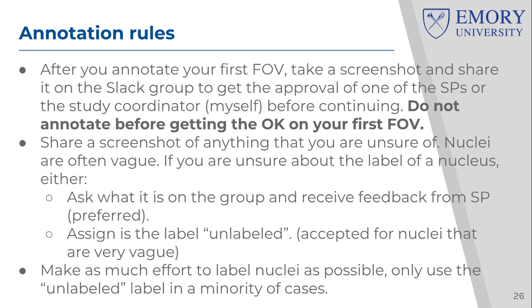Now this is for your own benefit, because if there's a systematic problem, for example, you're always mislabeling things, or your bounding boxes are always incorrect, or you have a misconception about what a lymphocyte is, or whatever. If you have a systematic error and you keep on annotating things quickly without getting any feedback, then we'll tell you, that's an error. Then you have to go back and correct all of this. So that's a waste of your time. So what you really want to do is do your first field of view, get feedback, and then once you get our OK and you're sure that you're doing things correctly, go on and continue.